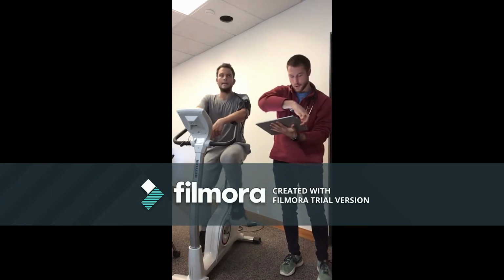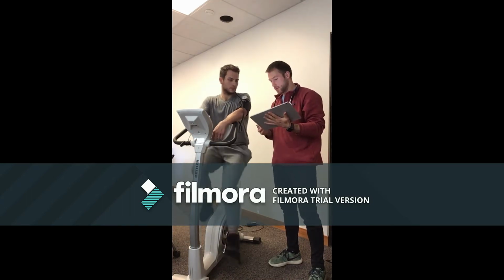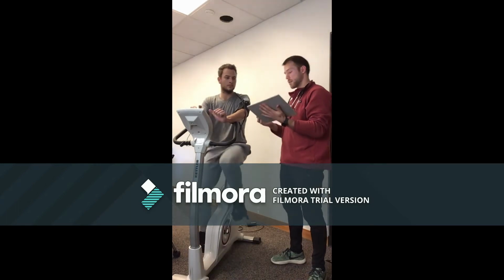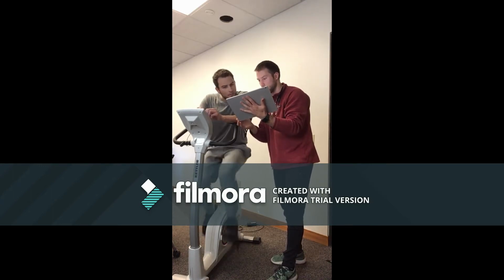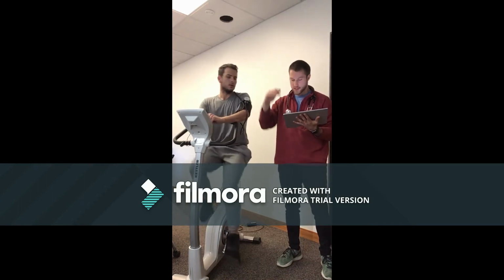Nice. So as we were talking about before, your systolic blood pressure went up a little bit. You're now at 146. Diastolic remained relatively the same. I got 80 on that. So overall, that looks great. What would you say your RPE was again on that scale from 1 to 10? It's a little harder than before. I'd say 14. 14? Yeah. Okay. Great. So again, that looks great along with your heart rate. It's kind of steadily increasing.